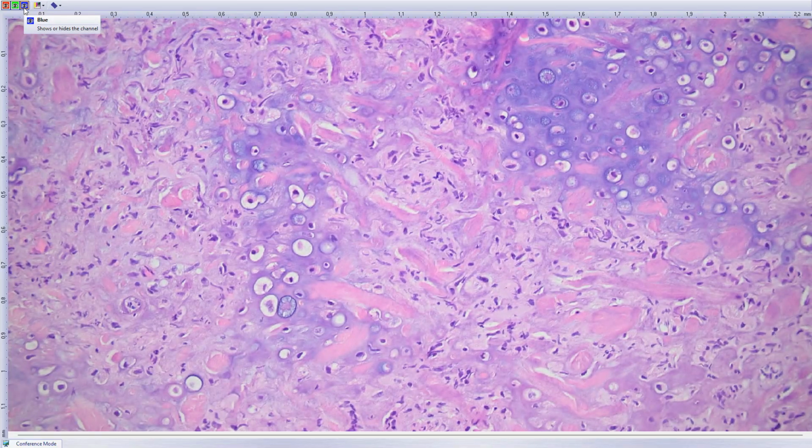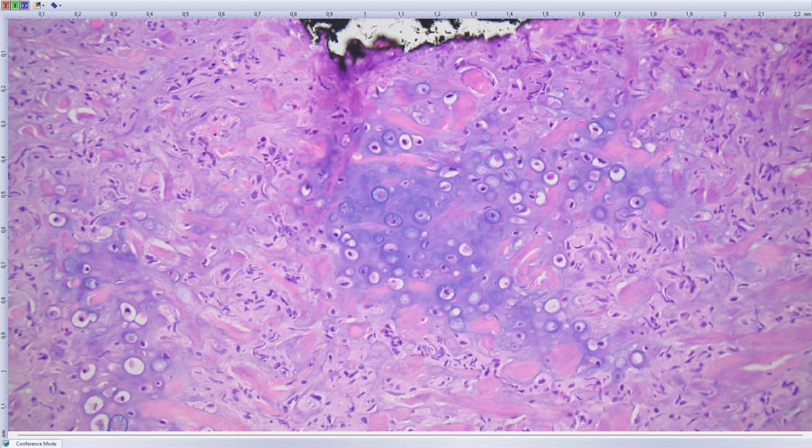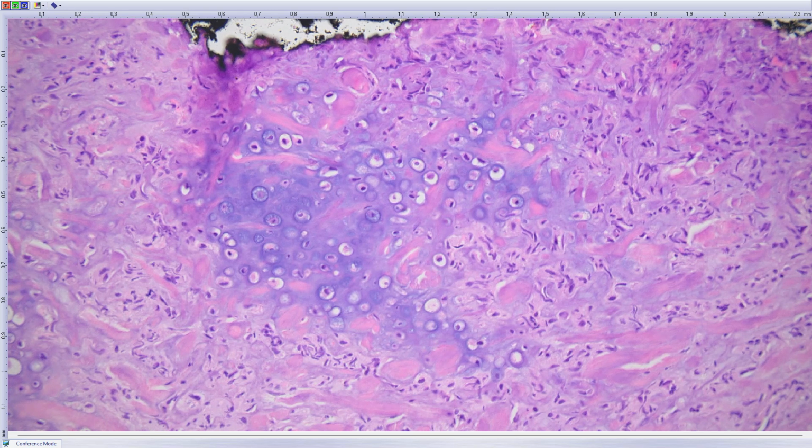But if you think about it, what kind of cartilage is present in the orbit, or in the facial bones? Facial bones are formed by membranous bone formation. There is no cartilage stage. The bone is formed directly from these stromal fibrous cells, not from the cartilage. And moreover, this cartilage looks a little bit atypical in my eyes.